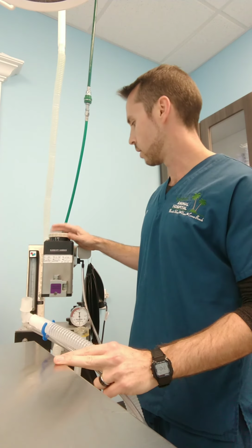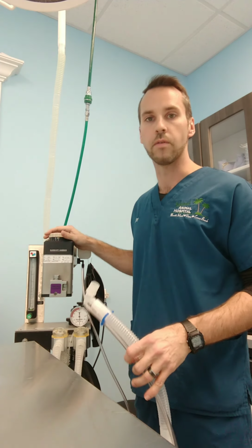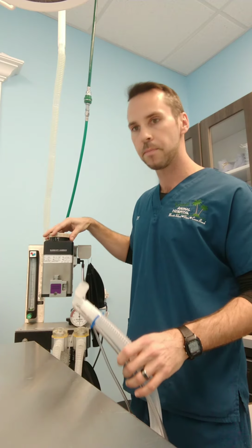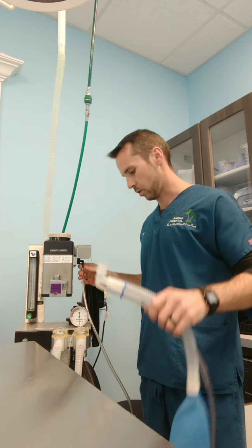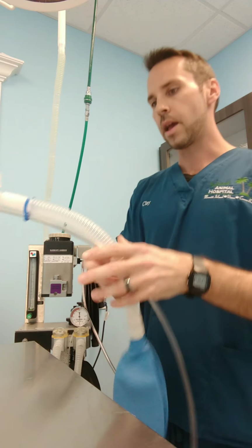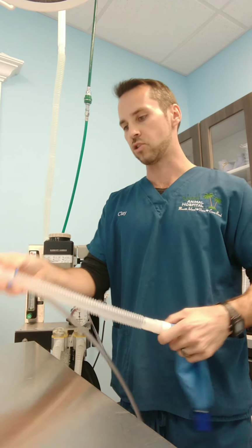Next to that, we have the vaporizer, which we use isoflurane. So this vaporizer controls the flow of isoflurane by turning this knob. And then that flows to the fresh gas inlet, which comes through this hose and goes to the breathing circuit, which this part hooks right to the ET tube of the patient.